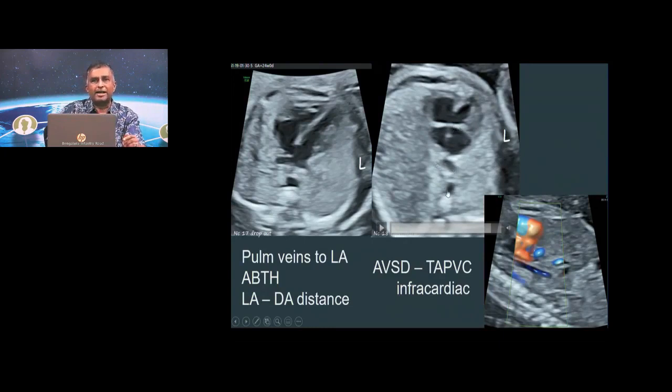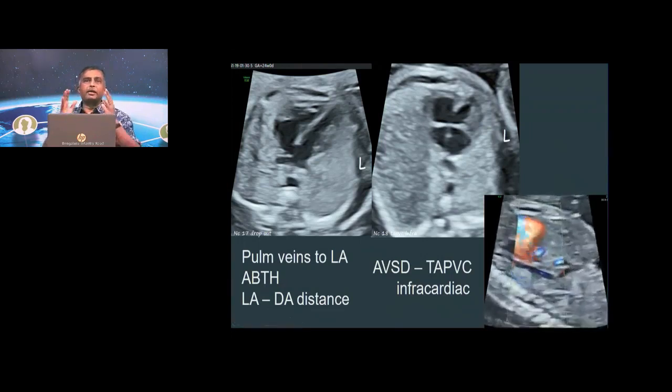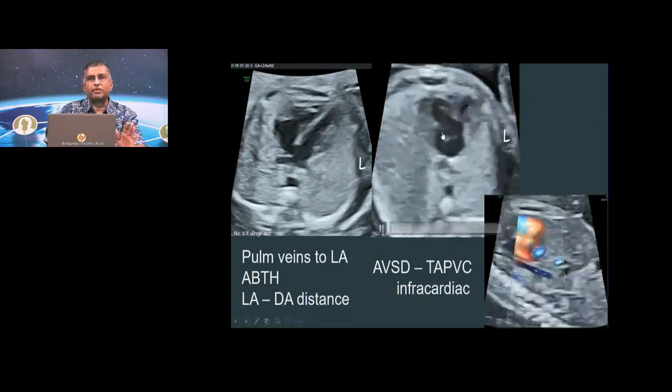And also look at how anteriorly this heart has moved. Normally, the left atrium is extremely close to the descending aorta over here. You only have the esophagus here. Here it's moved a mile away, and there's an extra vessel there. That is the anomalous pulmonary vein, and when I trace it, the pulmonary vein goes in, the vertical vein goes infracardiac, penetrates the diaphragm, and you can see the vein joining the left portal vein, umbilical vein, ductus venosus complex over there. So that is a TAPVC infracardiac, and this is mainly to show you that yes, there is loss of offset that you can see there.